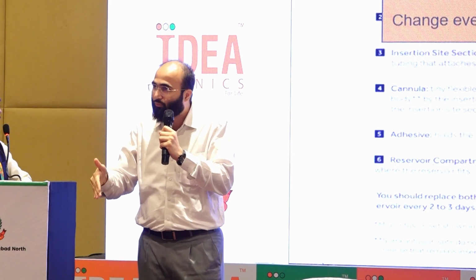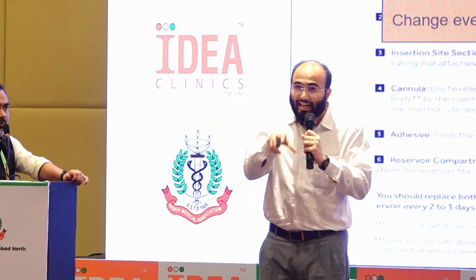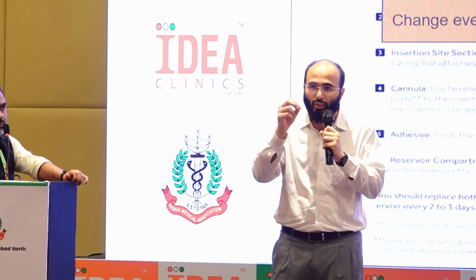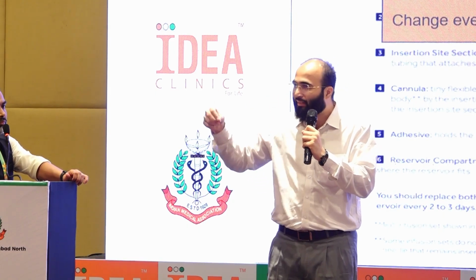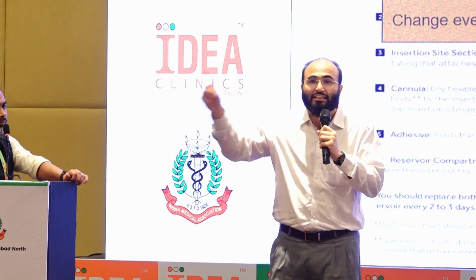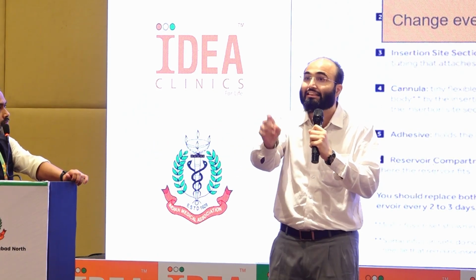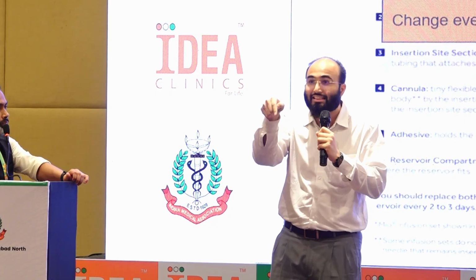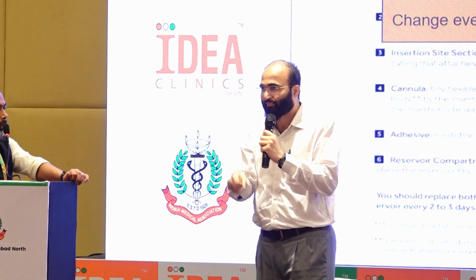This way it is less than 1 milligram drop. This is 2 milligram drop. So now the pump can anticipate if the sugar is dropping at a rate, say more than 2 milligram per minute, then in the next 15 minutes, the patient's sugar is 100 now. In the next 15 minutes, this can go to below 70, which is a hypo, and it suspends the delivery right now. That's number one.